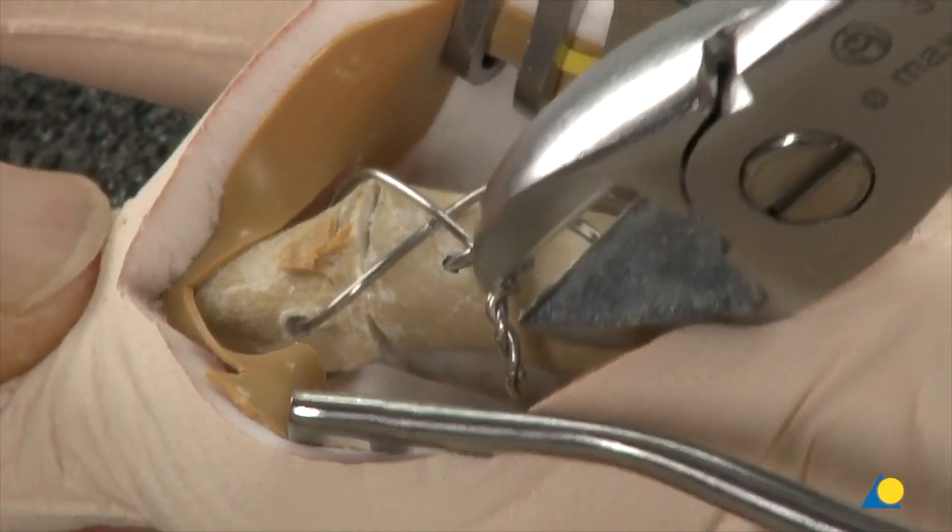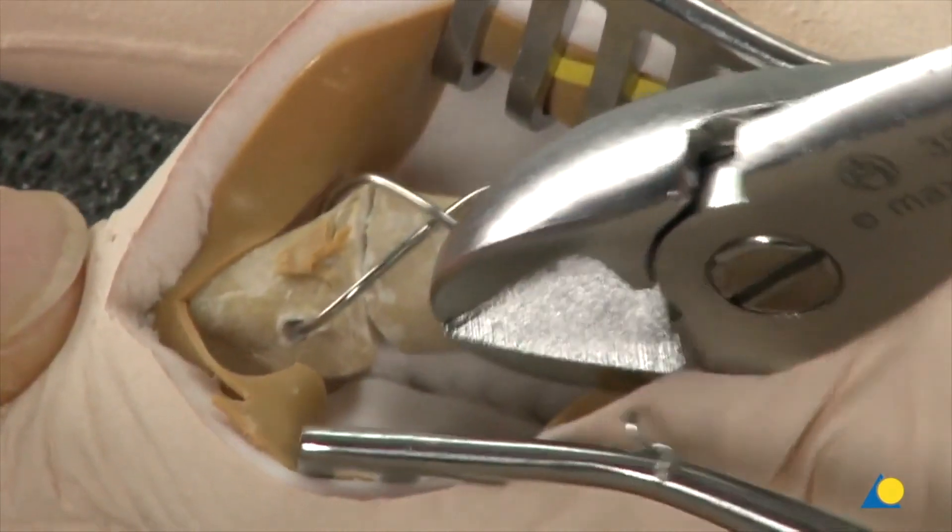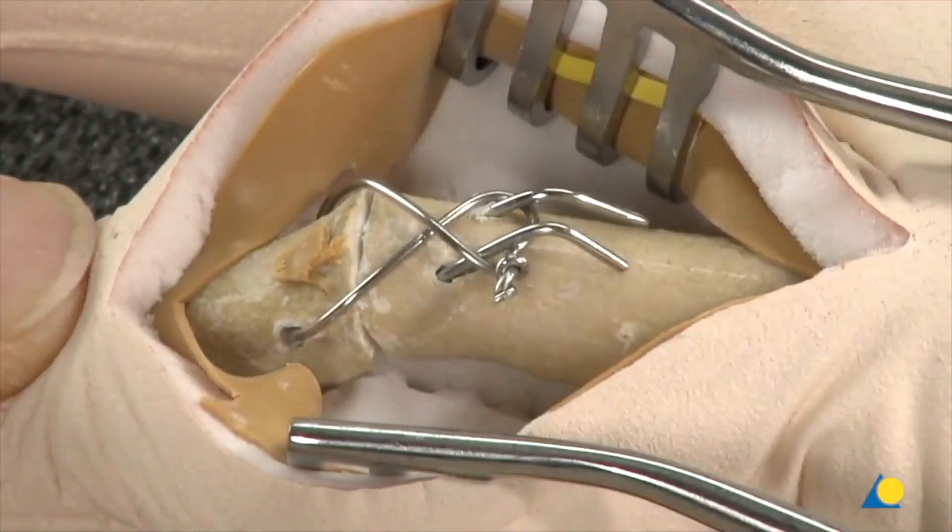Finally, the twisted circlage wire is trimmed and bent to the side to minimize irritation to the extensor apparatus. The extensor apparatus is repaired at the end using a running non-absorbable suture.